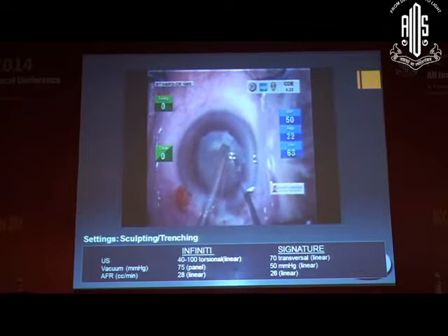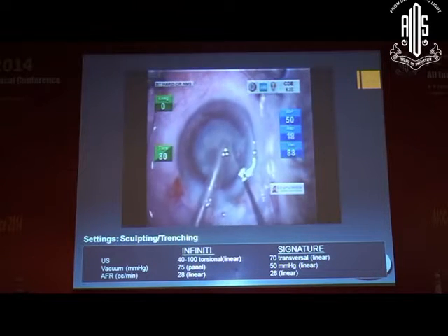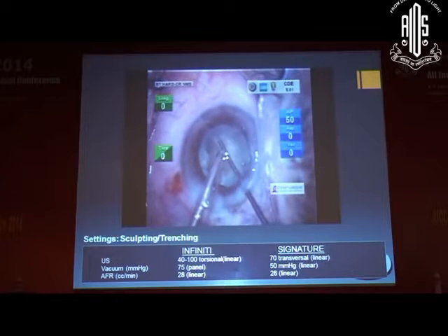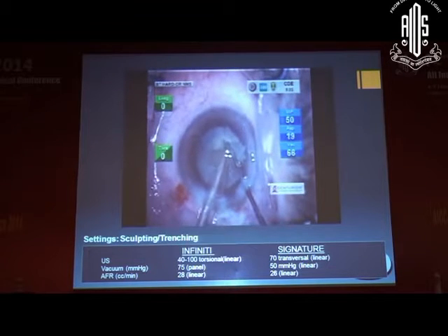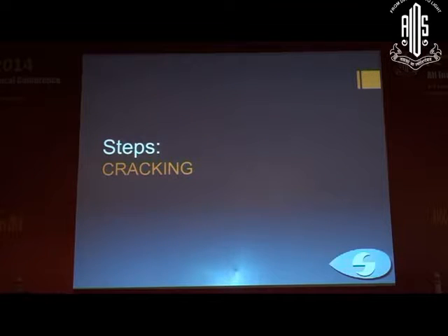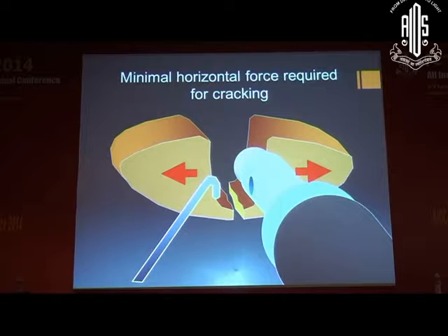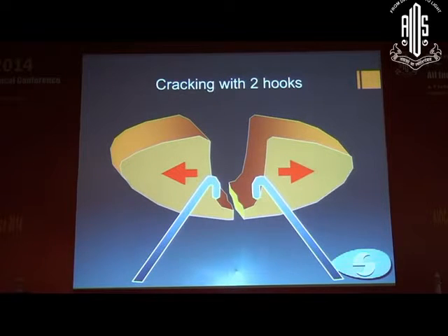Cracking to the center is essential because otherwise the central portion remains intact. As you can see now, almost the four grooves are complete, forming a four-quadrant pattern. This is the last grooving, and you see a Maltese cross at the end of the sculpting. You can crack with the phaco tip or a second instrument, requiring minimal horizontal force, and you can also use two hooks as shown.